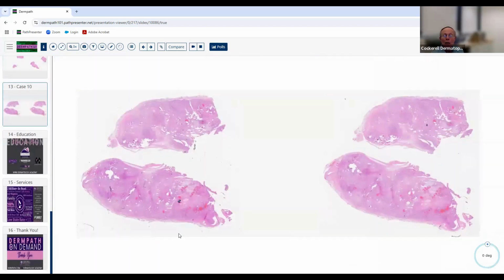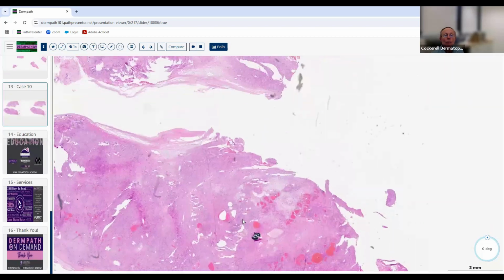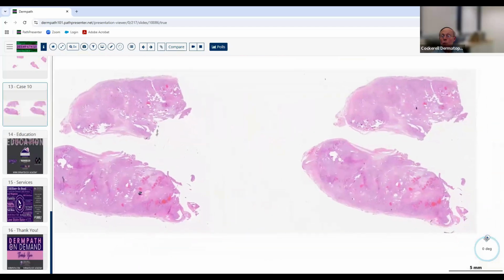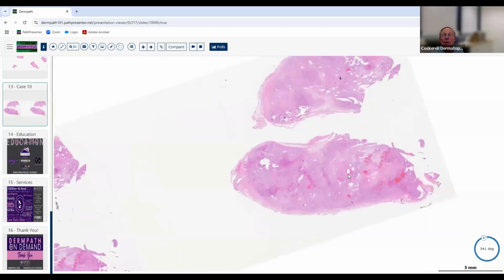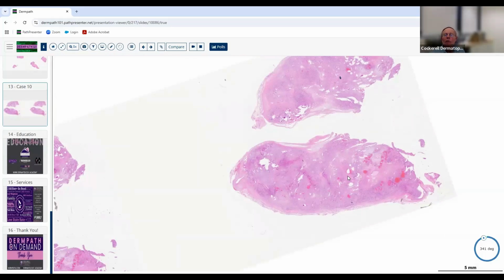Okay, the last lesion we'll talk about today, again, we've got an enucleation biopsy here. So this was one that, again, like our mixed tumor of the skin we saw earlier, might have been thought to be a cyst or something like that clinically, and this lesion is never diagnosed clinically. They usually present with a dermal papular nodule. The clinician thinks it's a cyst.